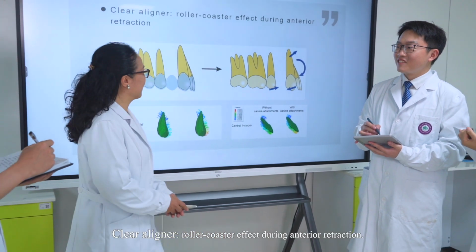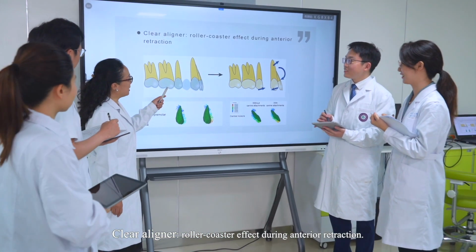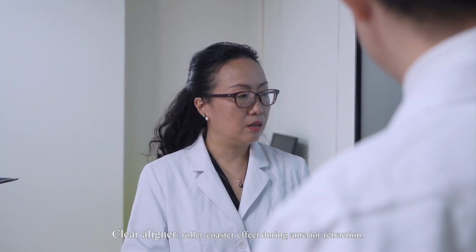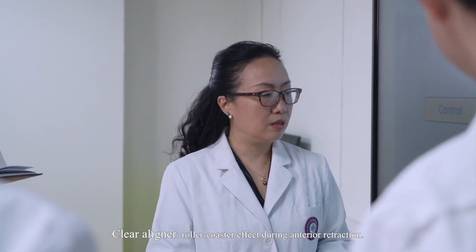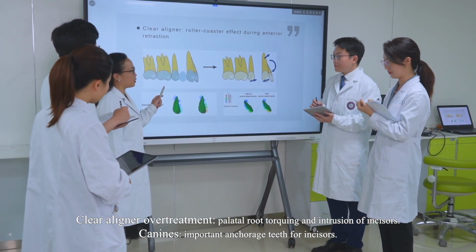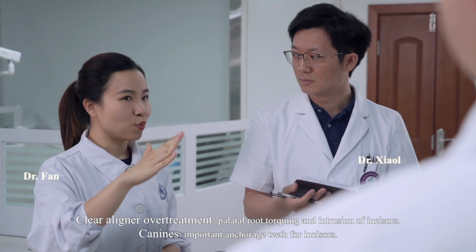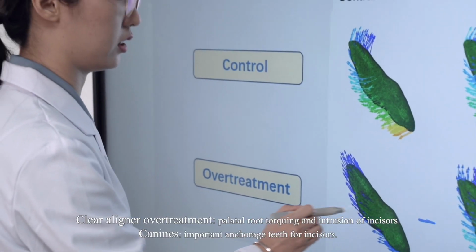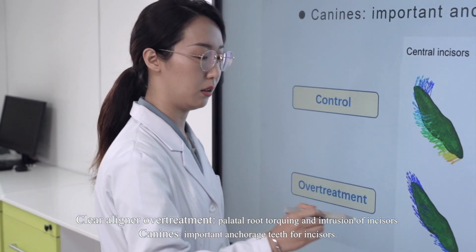Clear aligner therapy for extraction patients caused lingual tipping and extrusion of incisors, distal tipping and extrusion of canines, and mesial tipping and intrusion of posterior teeth, resulting in a roller coaster effect during anterior retraction. Overtreatment is effective in controlling palatal root torquing and intrusion of incisors, resulting in bodily retraction of incisors, but with less effect for lateral incisors than central incisors.